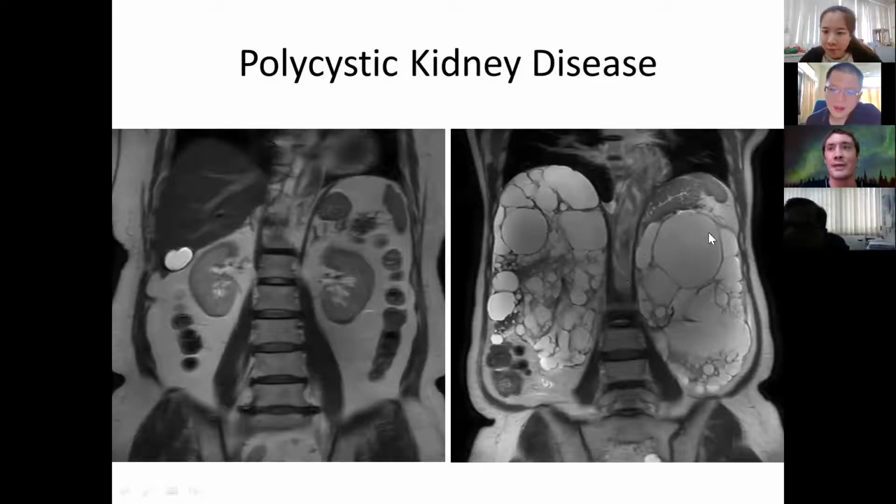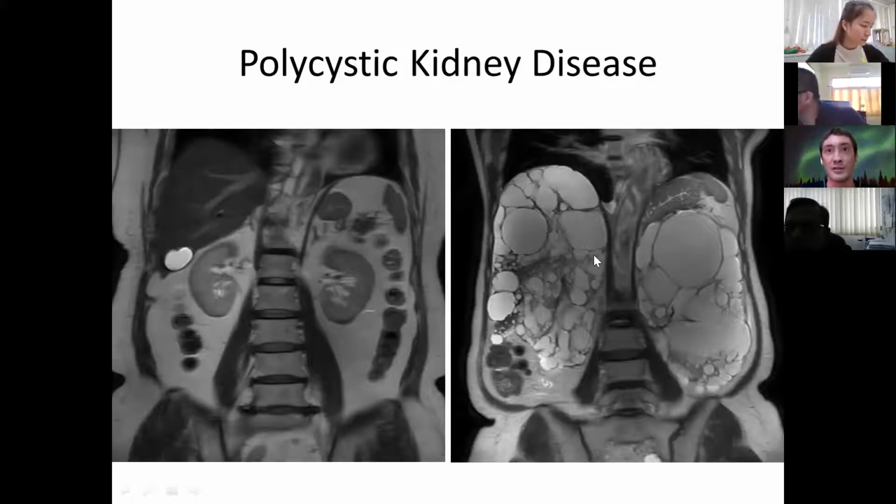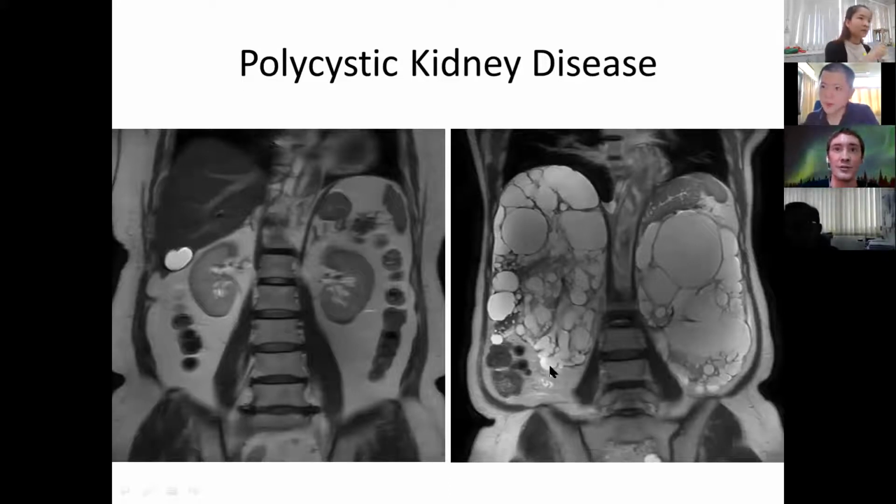So to monitor this disease, what the doctors have to do during their practice is analyze every image in an MRI scan and draw the contour around the kidneys. Cases where the kidneys look normal might be quite quick to draw around, but cases where there's a severe cyst load are difficult for the doctor to actually draw the kidney contour. So it's a time-consuming and laborious task.